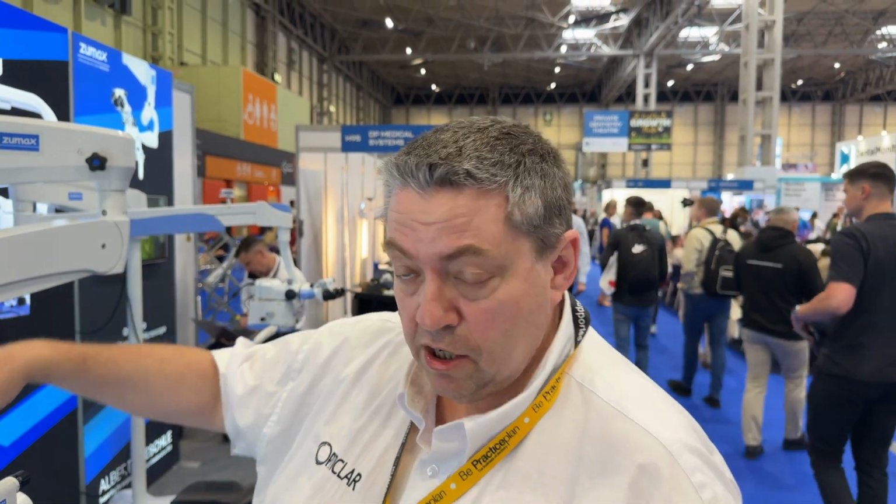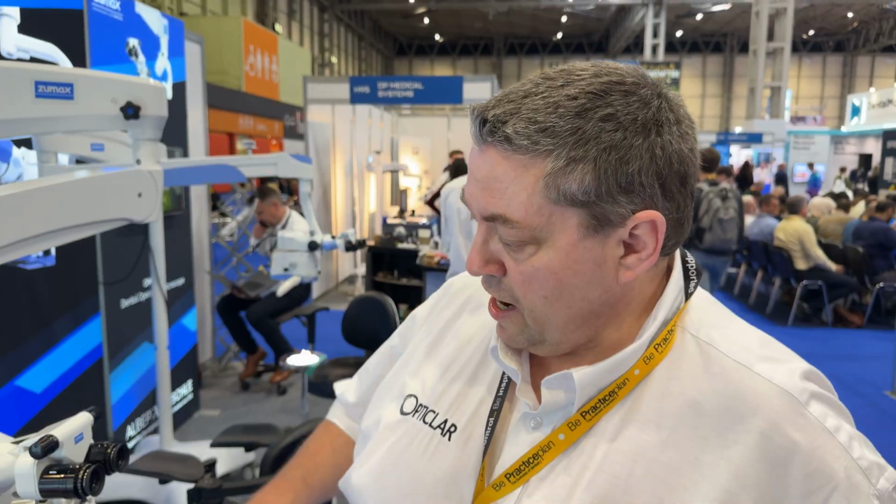It was the Navident system he combined it with. So it took the image from Navident, which was usually used for guiding people implanting, but he combined it with that to use for doing his root canal work. Well, what I've seen is guided surgery as well. So if you're doing an apicectomy or microsurgery, and you want to know where to drill for the end of the root, it's amazing, exactly. So that can be connected there.